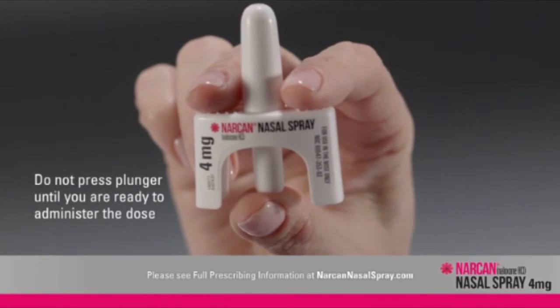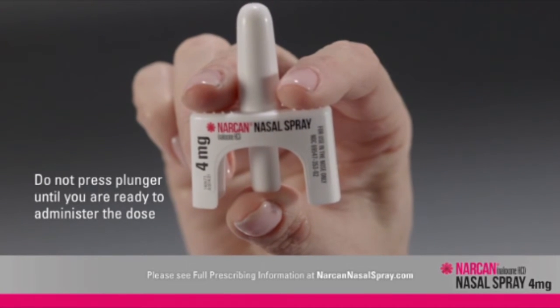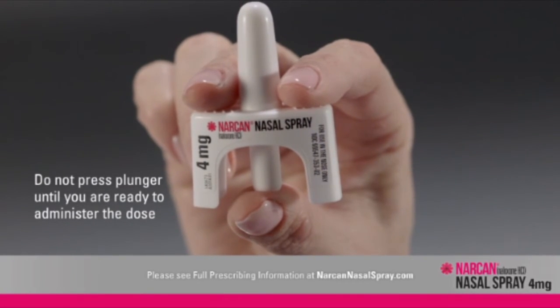Do not press the plunger to test or prime the device. If you do, you will waste all or part of the dose of medication.